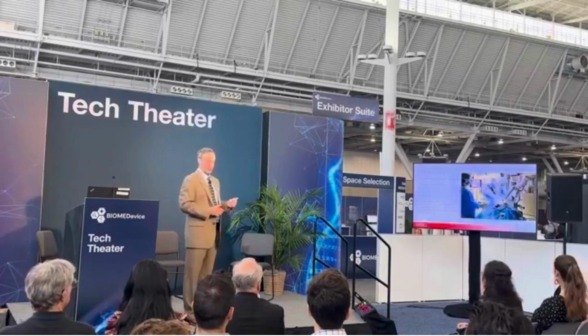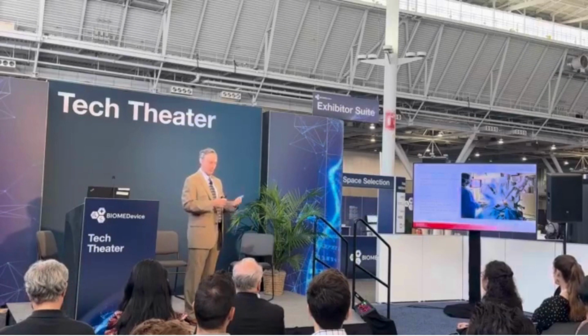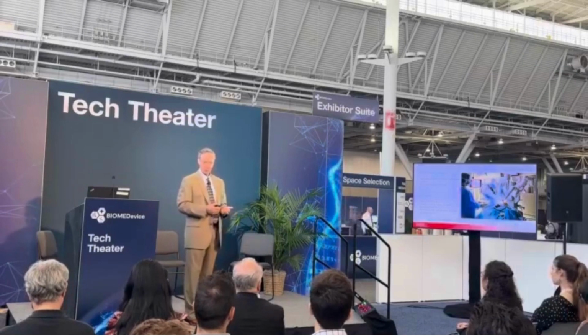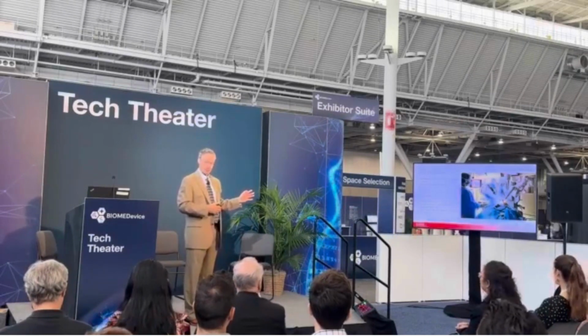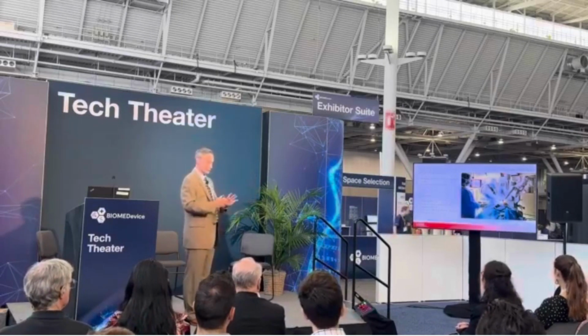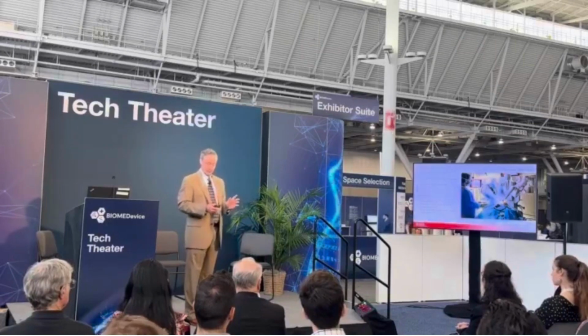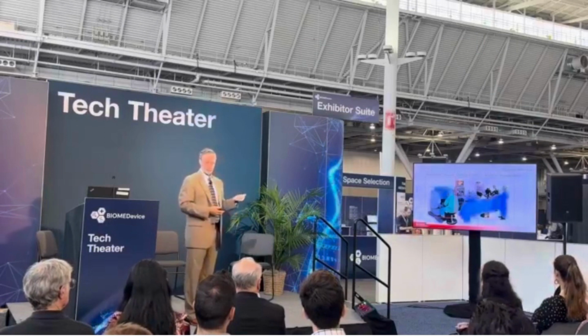You need a very trained staff with very low turnover to be successful long term. If you have two people coming and going every couple of weeks, it's really hard to set up this system. And you can see the setup involved. It's complex. It's a ridiculous enabler. However, the same five aspects still apply.